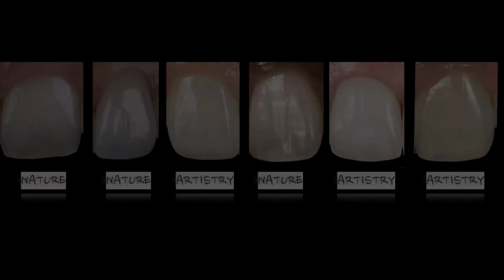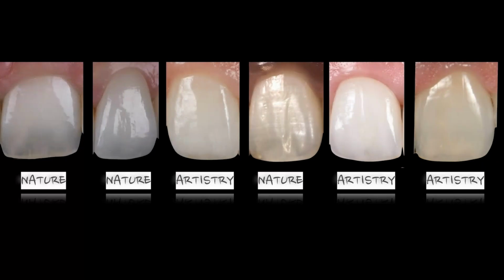One, I don't know if you guys realize, but not only is the topography kind of subtle, it's a very smooth, very small amount of ridges, but more importantly, look at the shine on the tooth, or the luster as we call it. And if you notice the luster on that case, it's what I would call a very low luster. And that might be one of the most complicated cases to do if we had to match that tooth. You already know that I did because I'm telling you it's fake, right? So why is that one so complicated? It's so complicated because not only is it difficult to get those fine little details, but it's also difficult to get them and keep the luster very low. And I'll go through that a little bit as we go through our time together.